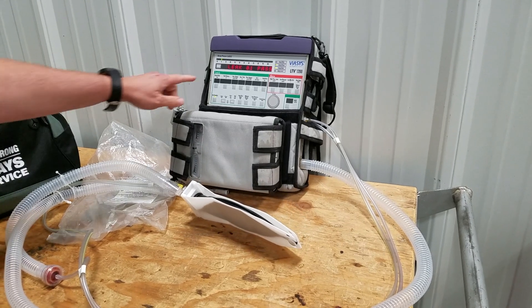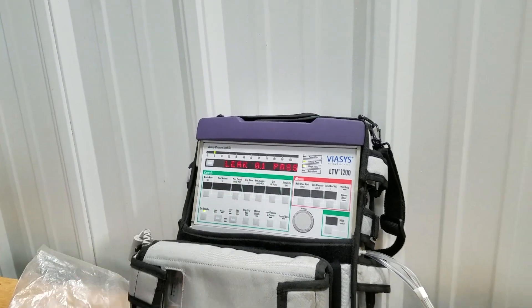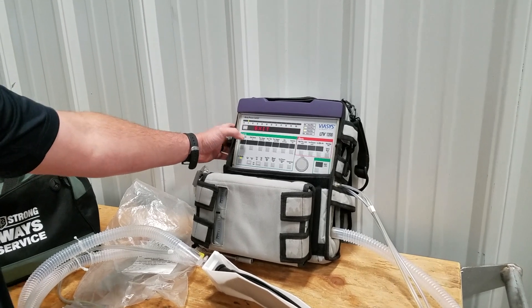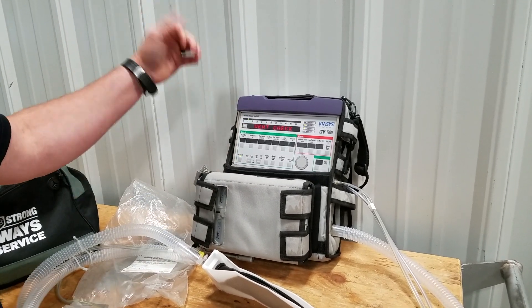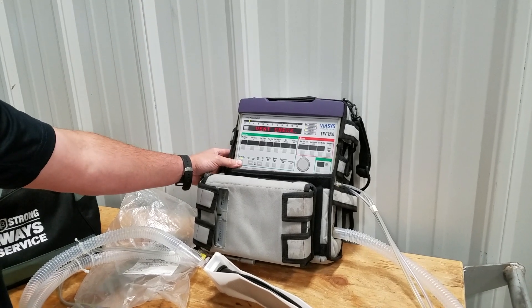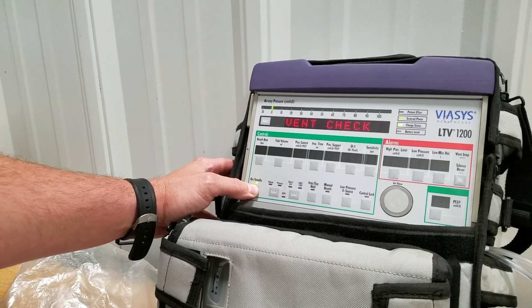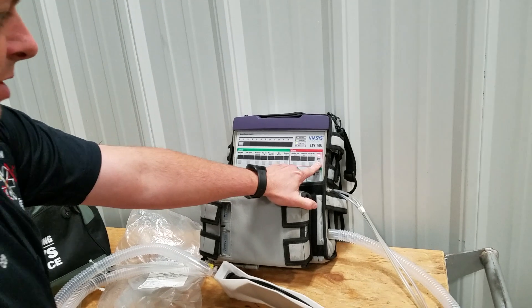You can see here for the leak test it says 0.1 and it does pass. We'll go ahead and press select again — that'll bring us to the exit screen — then hit select again and we're done. To turn the vent off, press the on/standby button again, hold it in, and then press the silence/reset button.